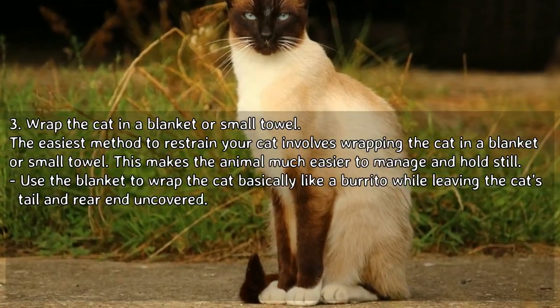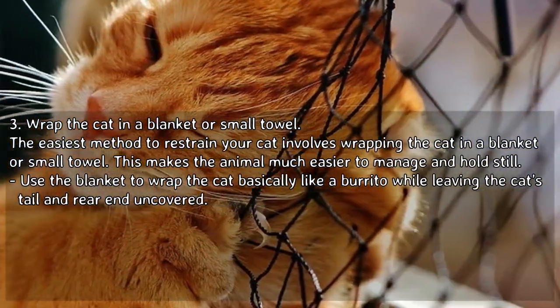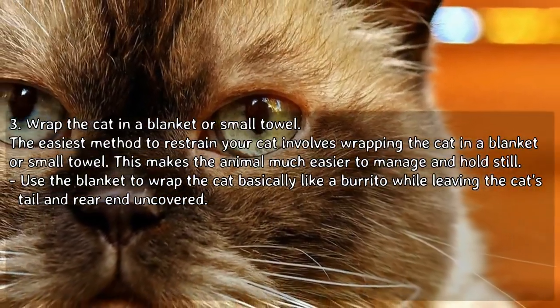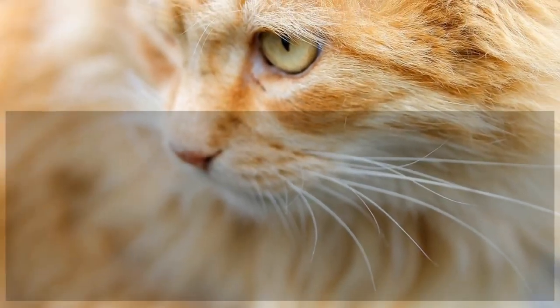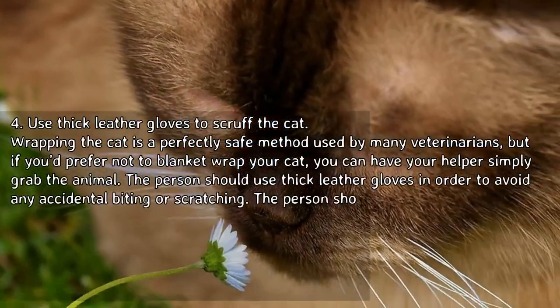Wrap the cat in a blanket or small towel. The easiest method to restrain your cat involves wrapping the cat in a blanket or small towel, making the animal much easier to manage and hold still. Use the blanket to wrap the cat basically like a burrito, while leaving the cat's tail and rear end uncovered.